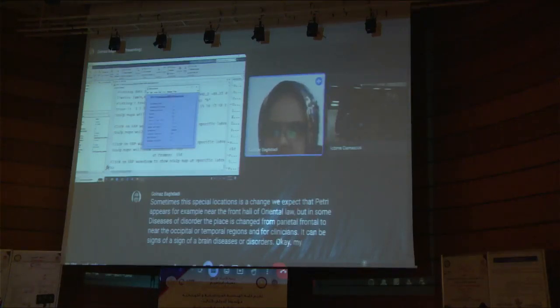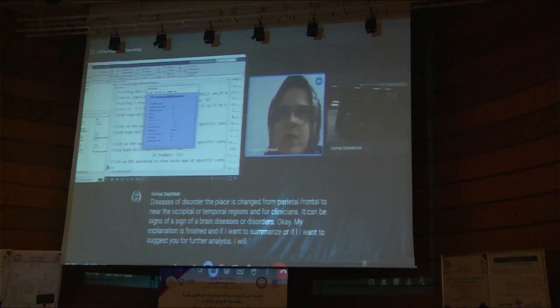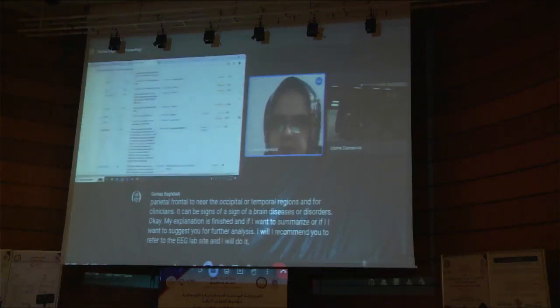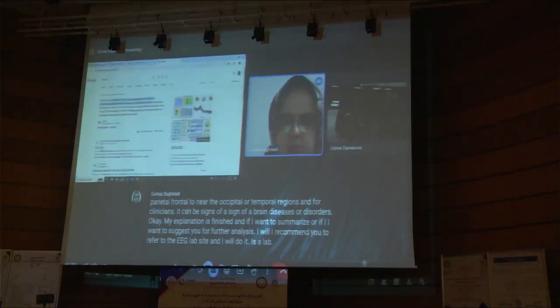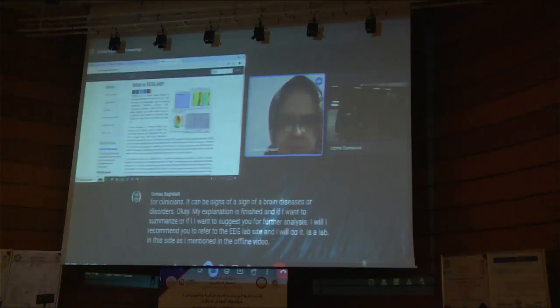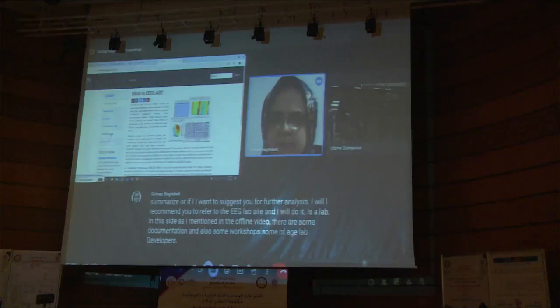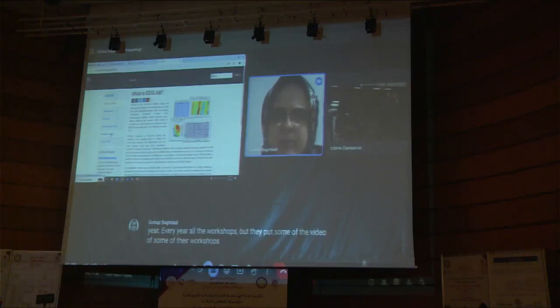My explanation is finished, and if I want to suggest further analysis, I recommend you refer to the EEGLAB site. In this site, as I mentioned in the offline video, there is some documentation and also some workshops. EEGLAB developers hold workshops every year, and they put some of the videos of their workshops on their site for free, but they are limited.